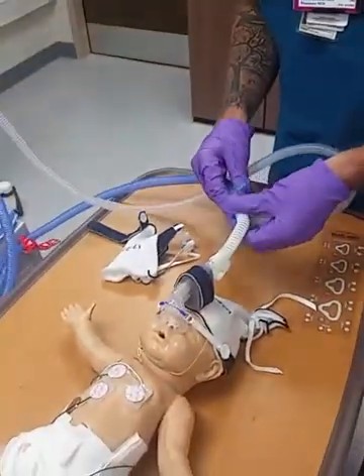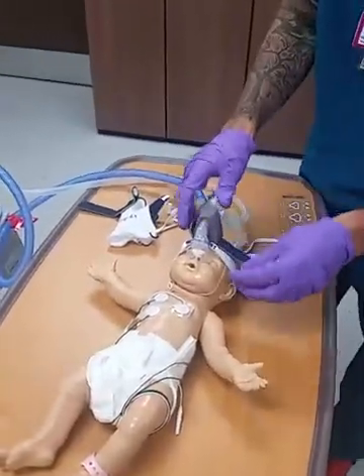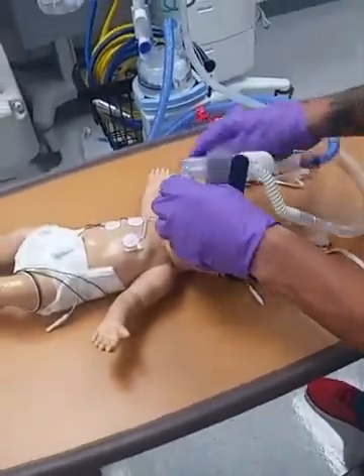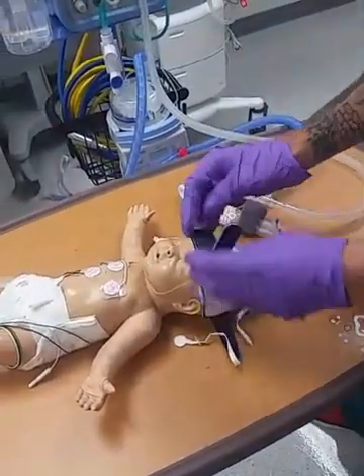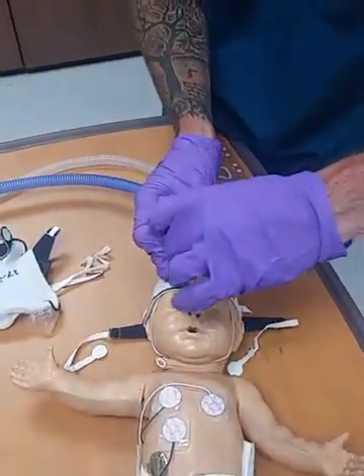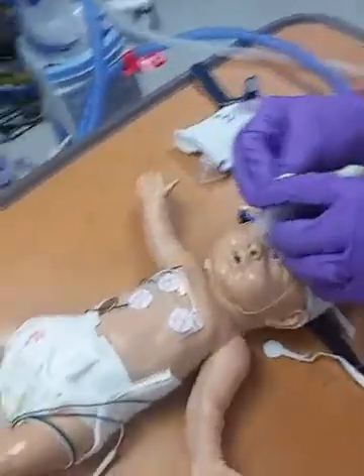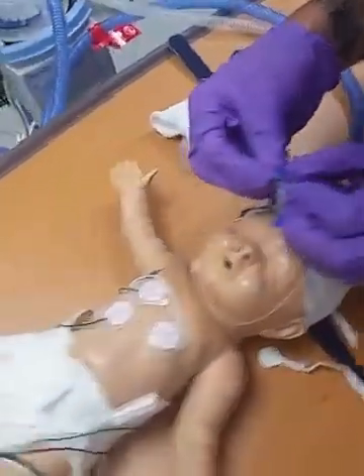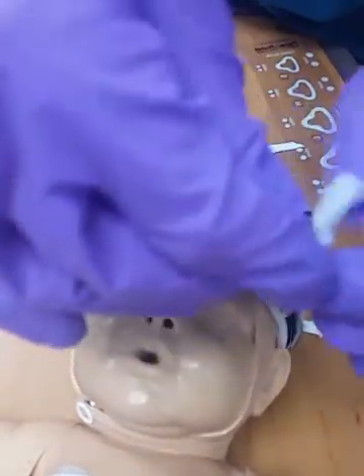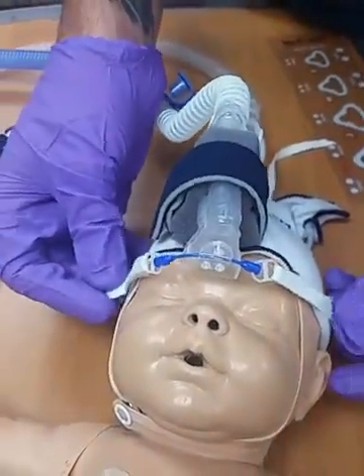Now we're gonna hook it up to the patient. So the kit's gonna come like this. First things first, you're gonna size your baby's head to get a nice tight seal. You're gonna grab the flexi trunk, place it right here, and secure it with this strap here. These are the securing straps for the actual flexi trunk — these little clips here, goes like that, do the other side, and then tighten them down simultaneously to get a good pressure seal.